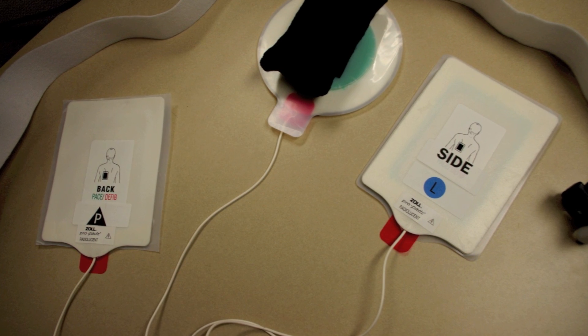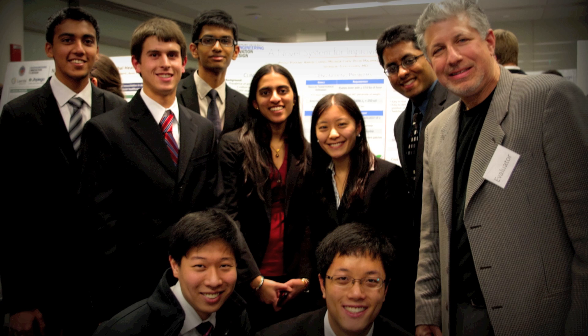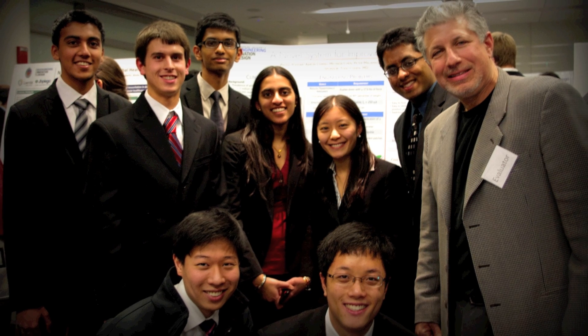We are currently in the process of designing, testing, and iterating upon various prototypes of the Presto Patch.